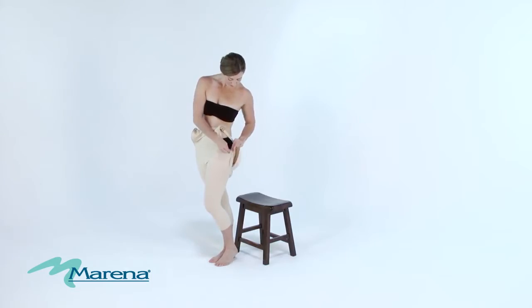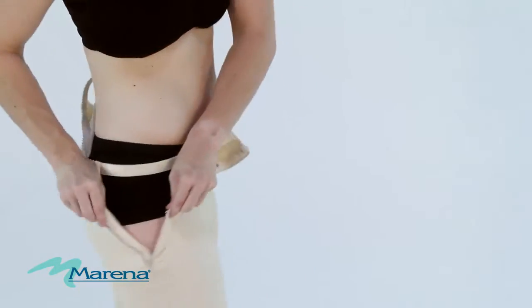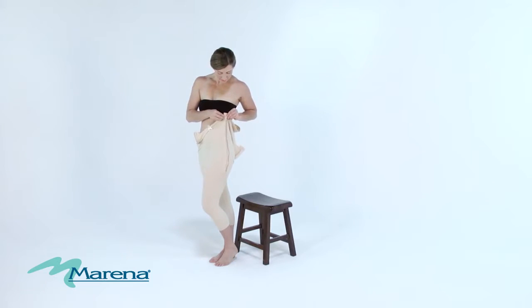Next, while fastening the hooks and eyes, alternate between the left and right side to ensure the garment is even on the body. Pull up on the garment after each hook.